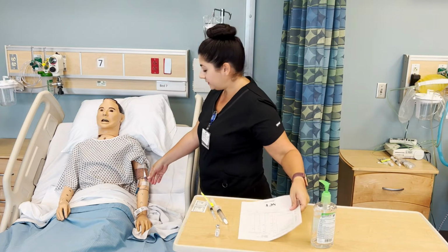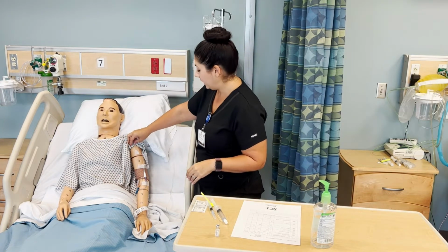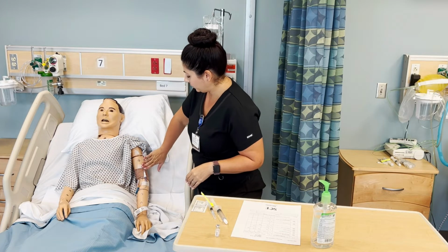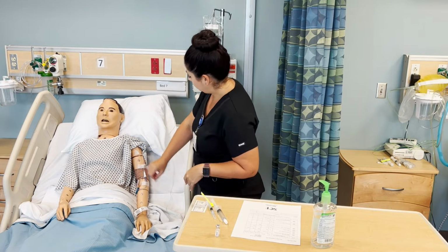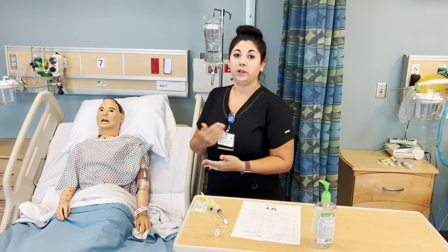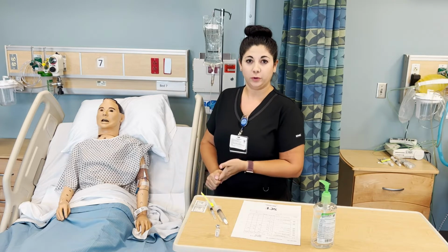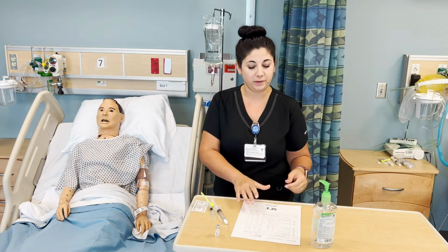Okay. How does this IV feel? I'm going to assess for inflammation or phlebitis, looking for any warmth, redness, swelling. It feels fine? Okay, great. And I'm going to pull out my drug cards and explain to the patient what medication they're getting, what it's for, and what the possible side effects would be.